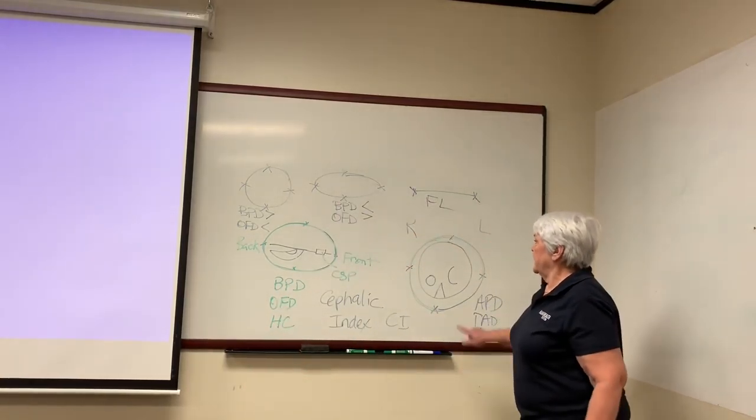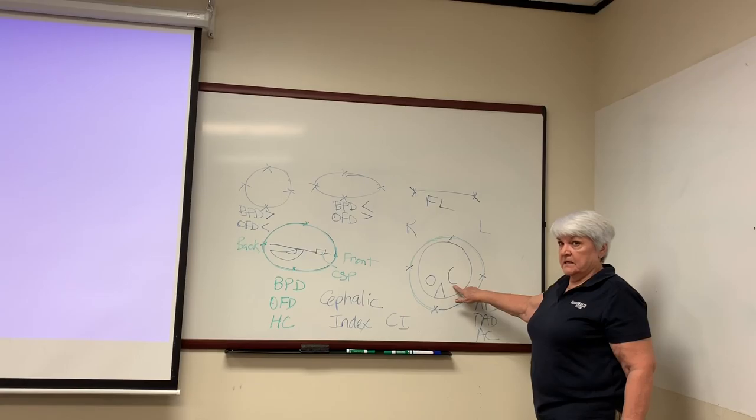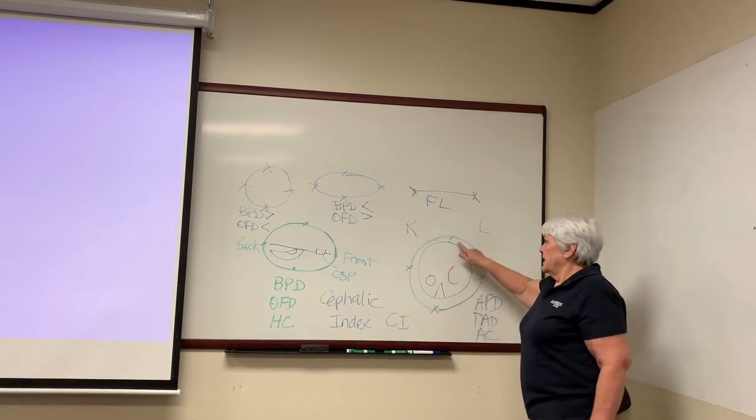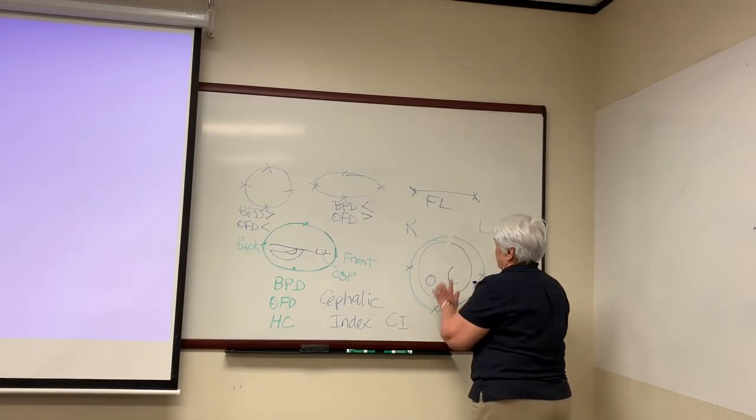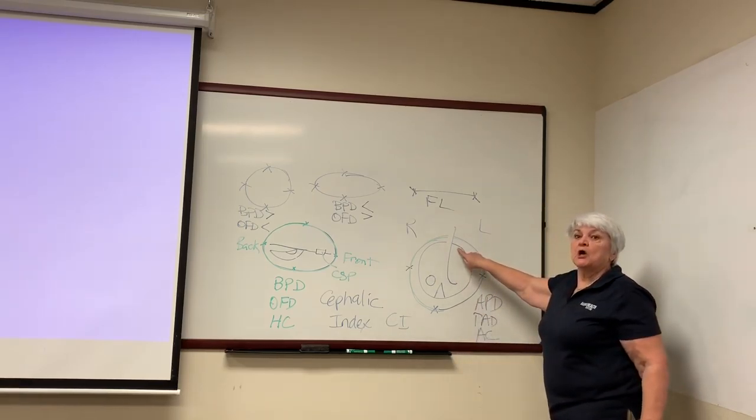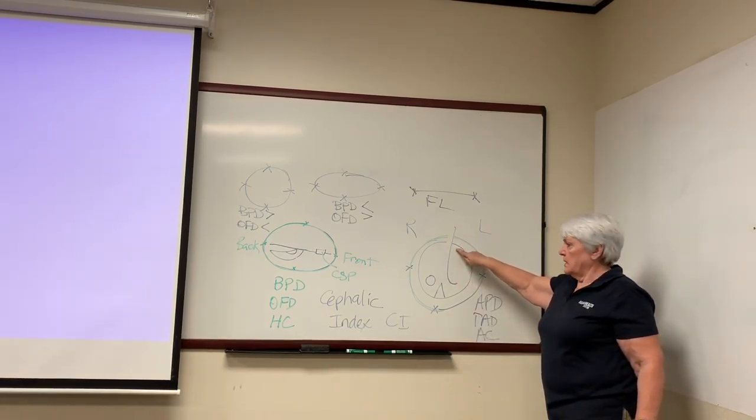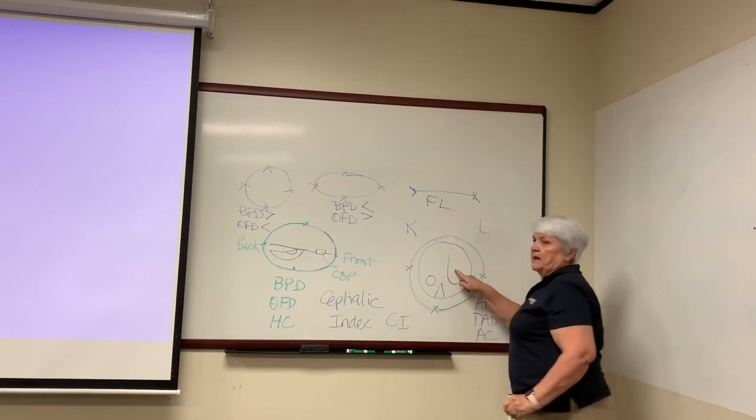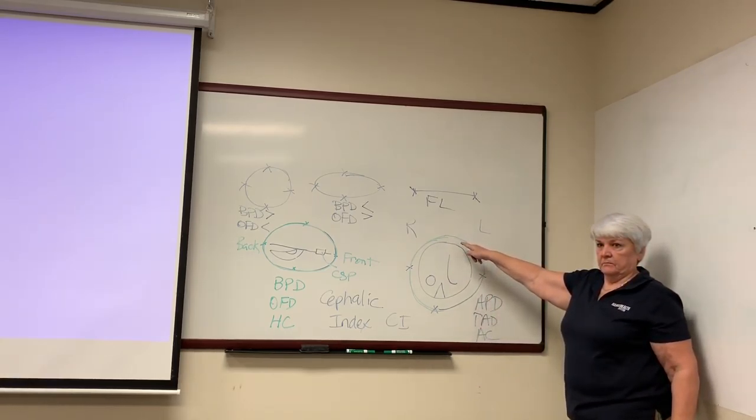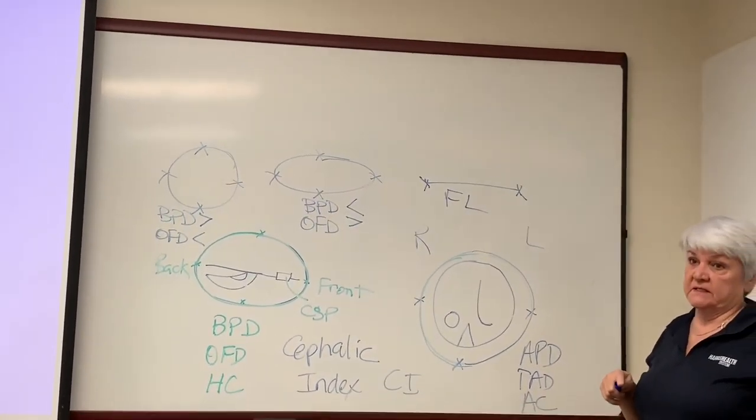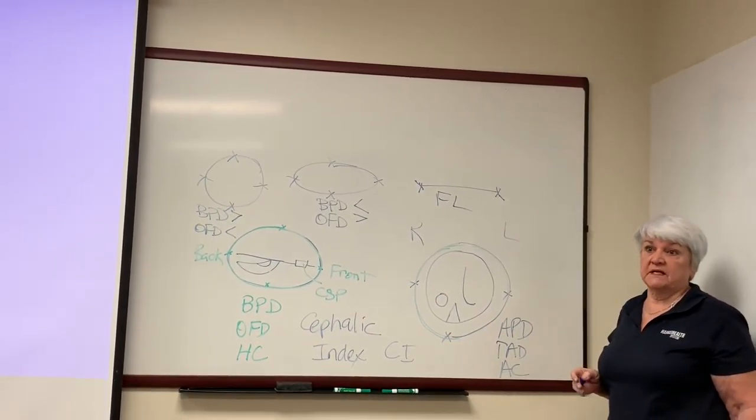I'm going to look at where the umbilical vein goes into the liver and joins the portal system. It's like a little hockey stick. If I see this, I'm too low. I want to come up on the baby because I don't want to see the umbilical cord going into the skin at this level. I am going to do a cord insertion into the fetus and also a cord insertion into the placenta.